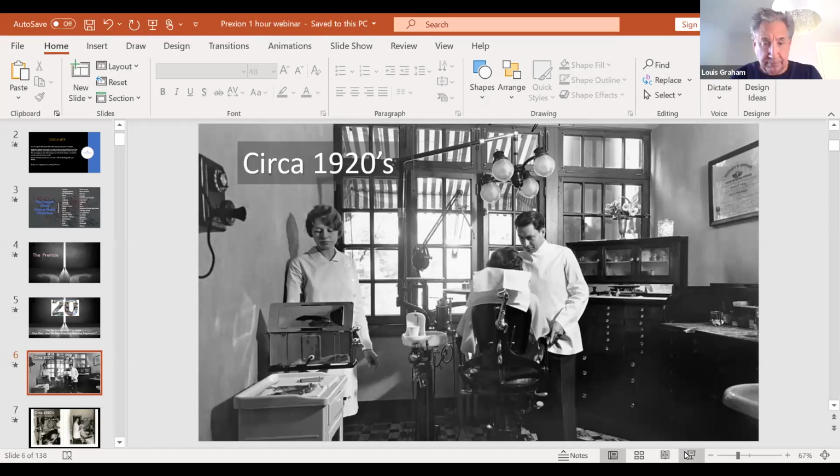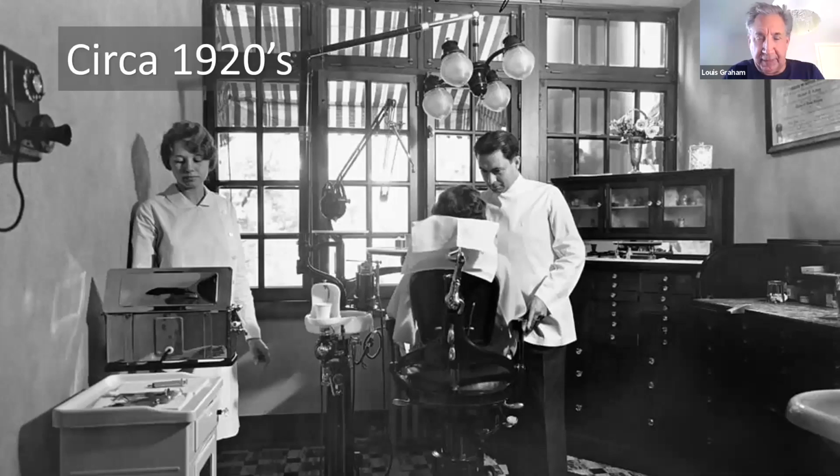Here we go. So circa 1920s, what was diagnostically driven dentistry? I mean, obviously, we're not talking pandemic, even though this was post swine flu pandemic as it were. Well, really, what was diagnostic dentistry? It was an explorer. I doubt they were even using perio probes. And they would be basically using sporadic x-rays, sporadic.